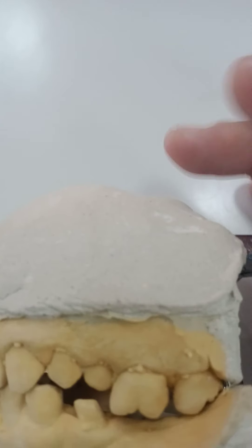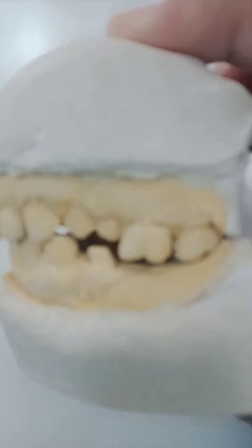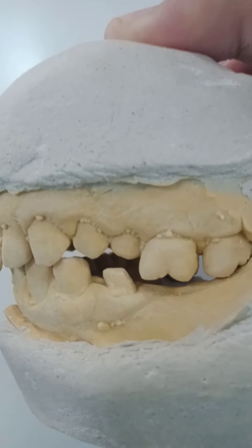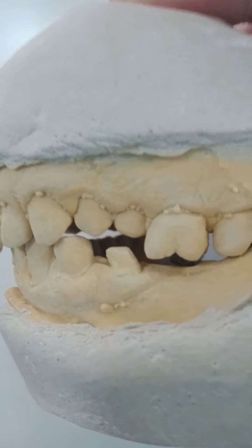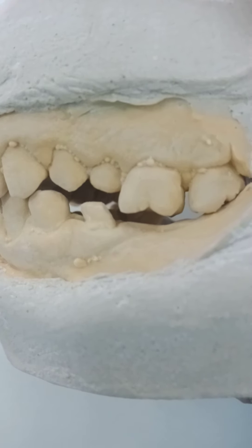Assalamu alaikum. This is a case where we have an interrupted occlusal table — an upper occlusal table. It was interrupted by the over-eruption of the upper teeth towards the lower edentulous area.